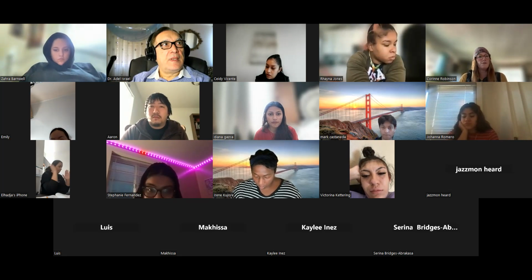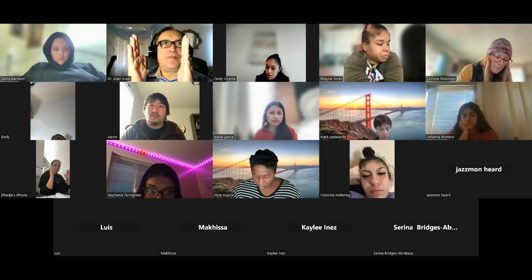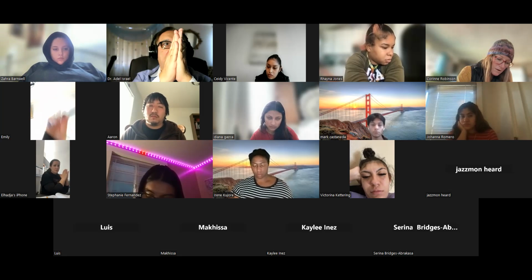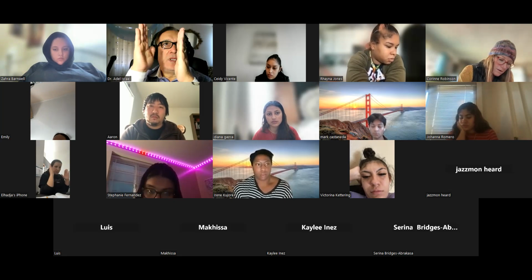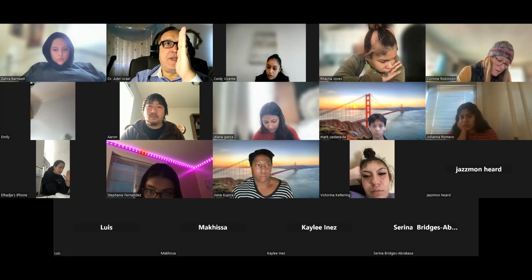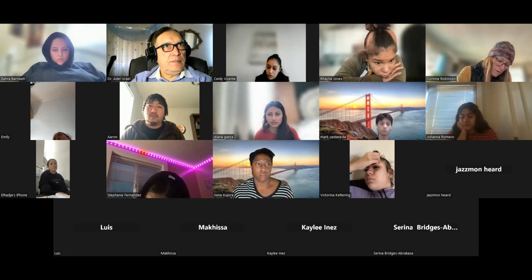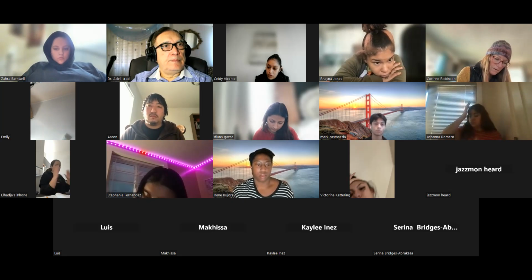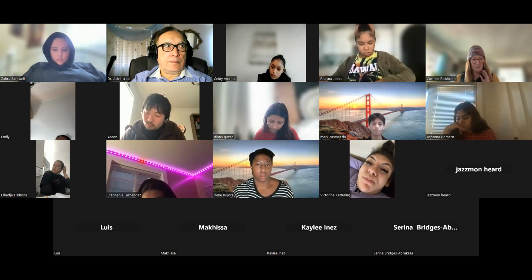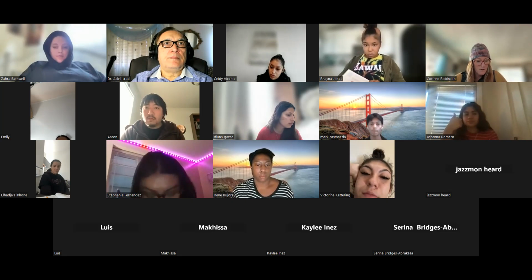Again, I will repeat the 3 leads. Lead 1, right arm to left arm. Lead 2, right arm to left leg. Lead 3, left arm to left leg. Clear, guys? All right, got it. Thank you. You're welcome.